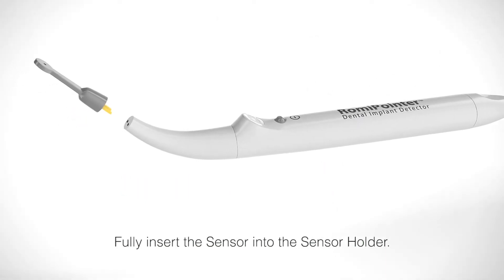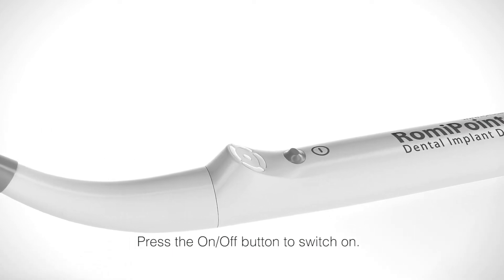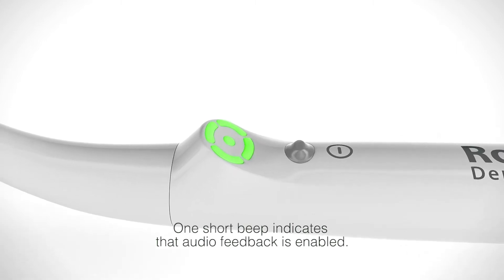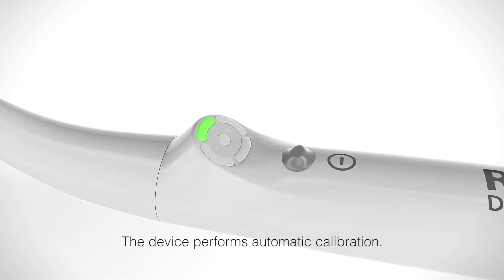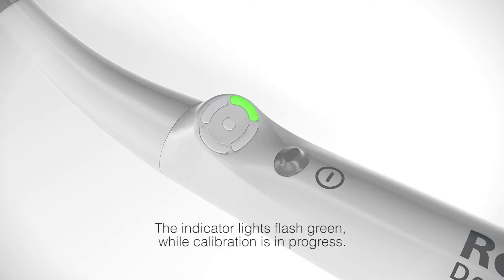Fully insert the sensor into the sensor holder. Press the on-off button to switch on. One short beep indicates that audio feedback is enabled. The device performs automatic calibration. The indicator lights flash green while calibration is in progress.